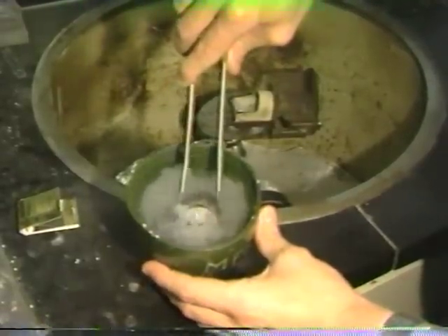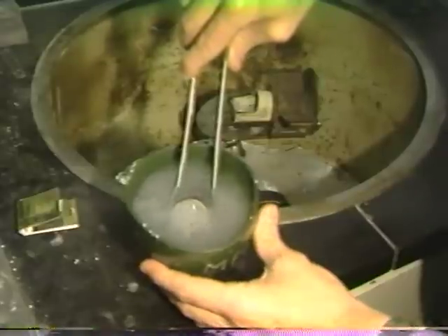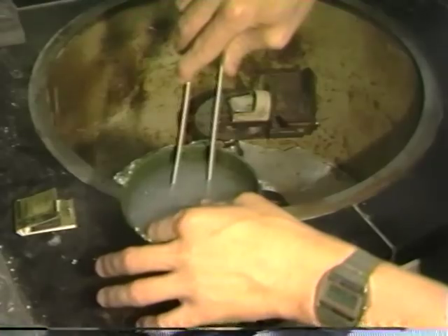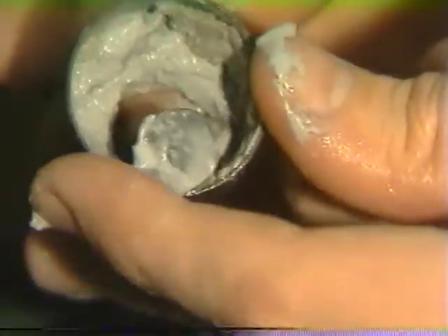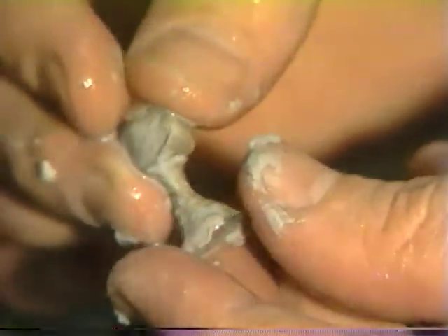When you do this in a sink, please throw the investment in the trash can rather than in the sink. The casting can now readily be retrieved by pushing the entire assembly out of the ring. The casting is then retrieved and cleaned with a toothbrush under running water.